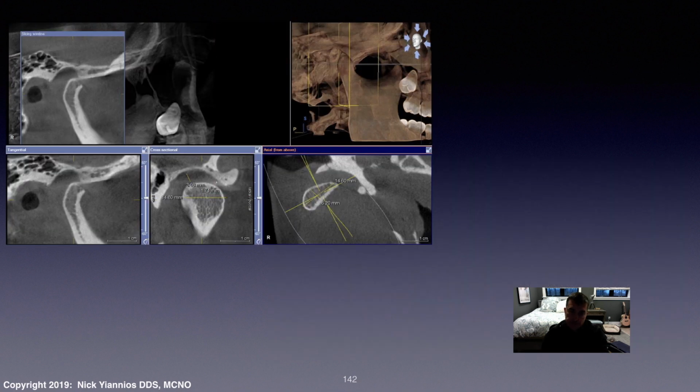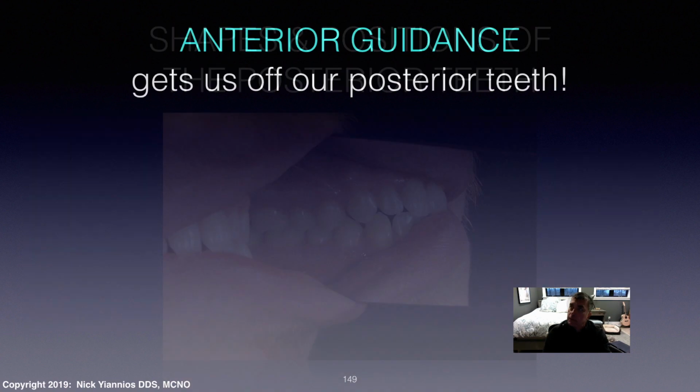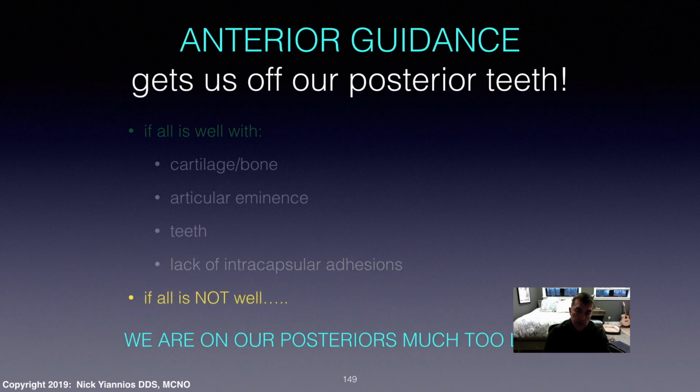Here's another example. The glenoid fossa, that upside down hillside that is the eminence, things look pretty good there. With the lingual inclines of the upper anteriors, especially in the excursive movements. And there's ways to read bites and look clinically to see if things are right or wrong, and I can kind of read into the orthopedics based on clinical presentation. But essentially the anterior guidance gets us off our posterior teeth. If all is well with the cartilage, then the bone, the eminence itself, the teeth, and a lack of intracapsular adhesions. If it's not well, we're on our posteriors much too long.